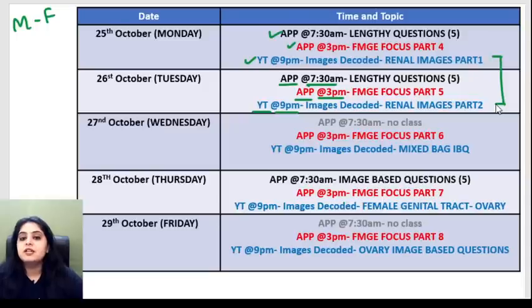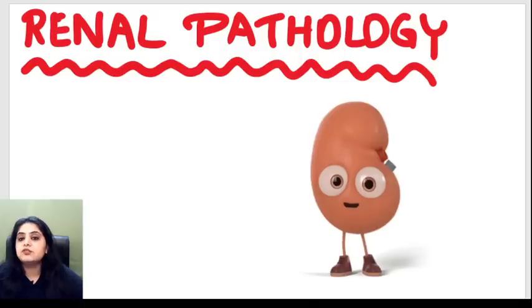So for today and tomorrow, we are going to cover a chapter that is renal pathology, kidney path images. We undoubtedly know that this is something extremely important.